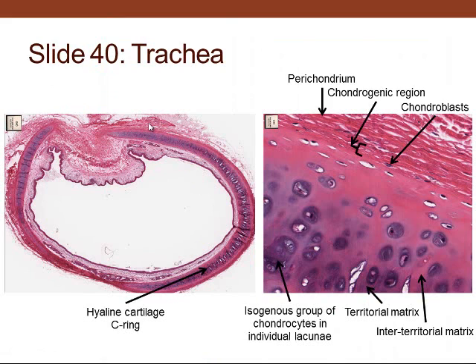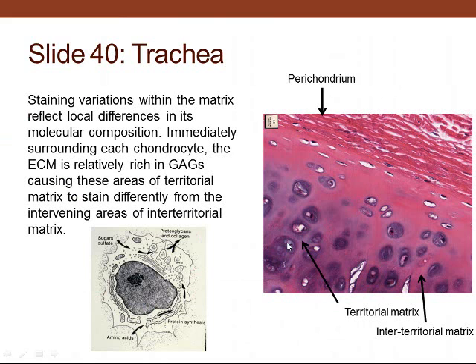If we look at hyaline cartilage in the trachea, we can see the cartilage in through there. We have the perichondrium, and there's chondrocytes, and then there's a chondroblast, and then they give rise to chondrocytes whenever they get trapped. Territorial matrix is the matrix shared by different ones. Isogenous groups, where one cell is divided by mitosis to produce other cells with interstitial growth.